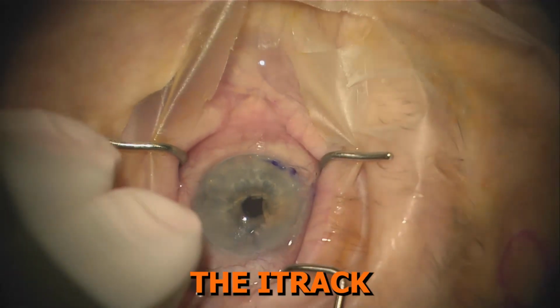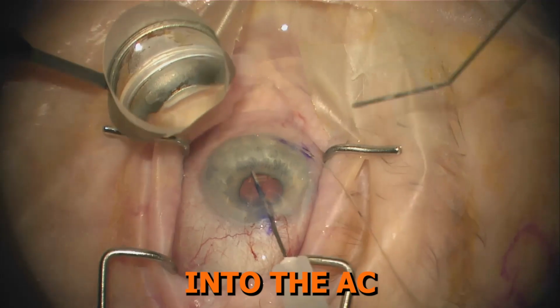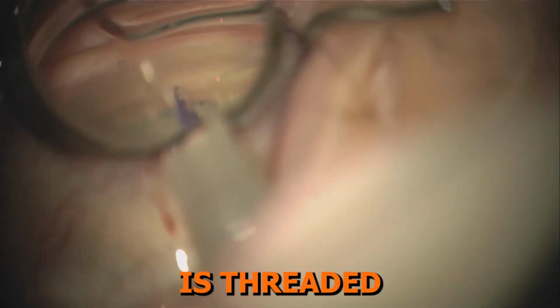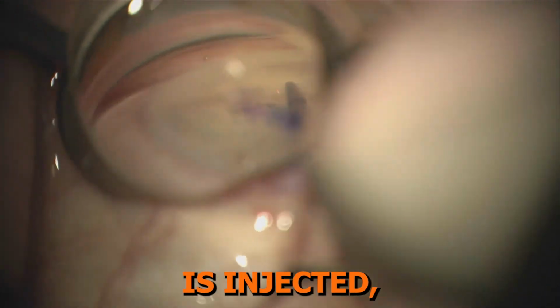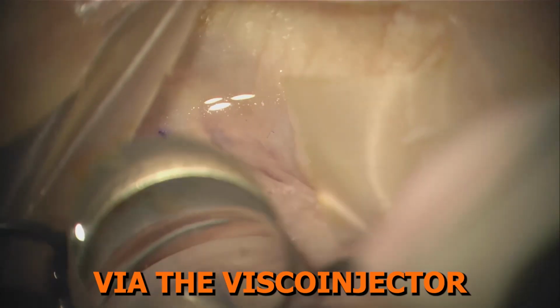Let's watch the iTrack in surgical action. After creating a corneal incision to introduce the catheter into the AC, a goniotomy incision is created. Then the catheter is threaded into Schlemm's canal for 360 degrees, seen tracking with the illumination. As it is withdrawn, viscoelastic is injected, expanding the canal and breaking up adhesions. This is done while instructing the scrub nurse to simultaneously deliver viscoelastic via the visco injector.